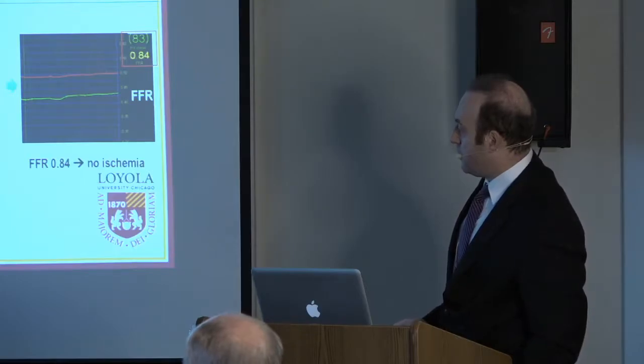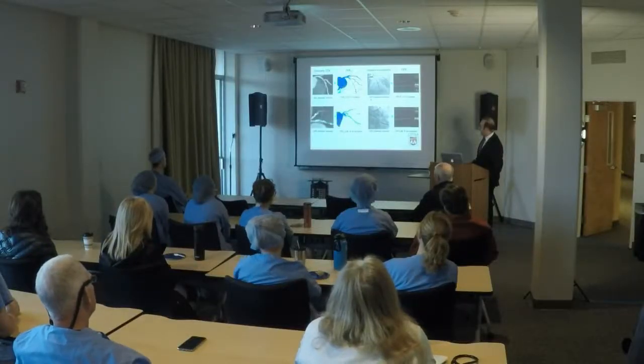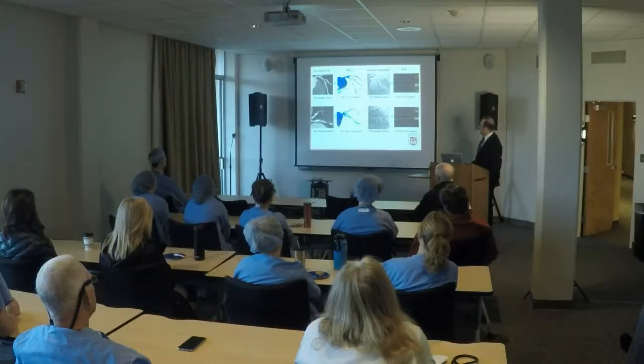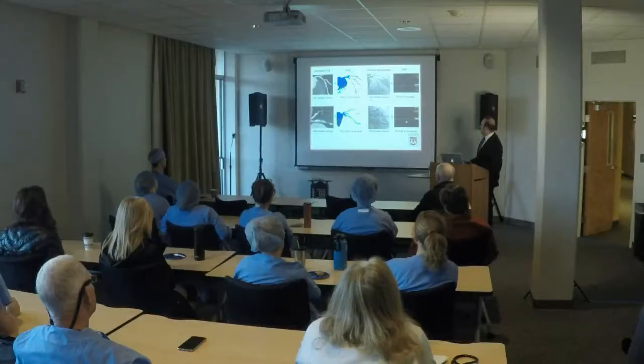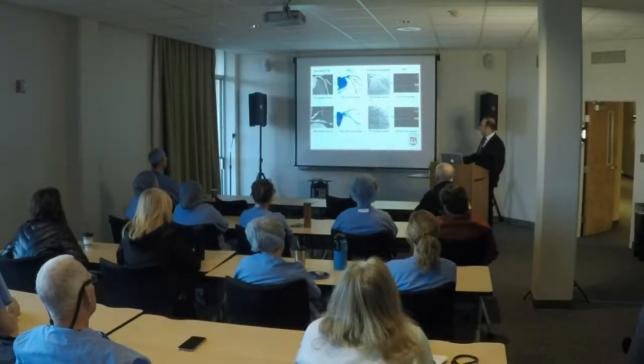Here's patient number 2 with a circ lesion here, greater than 50% diameter stenosis. The FFRCT was negative, so 0.85 above the 0.8 threshold. And the invasive angiogram corroborated the CT, and again, the invasive FFR suggesting no ischemia in that circumflex. This patient could be treated medically.